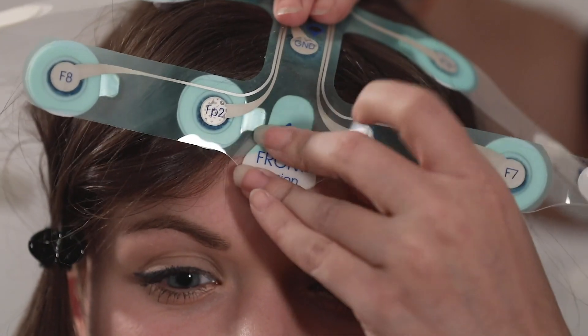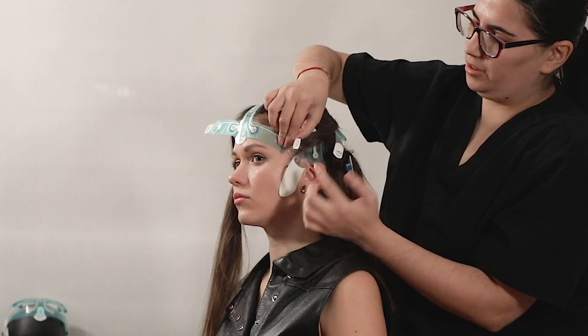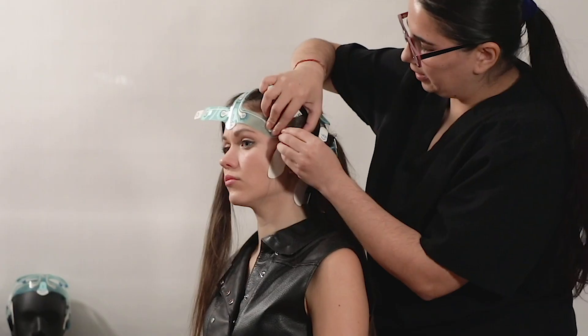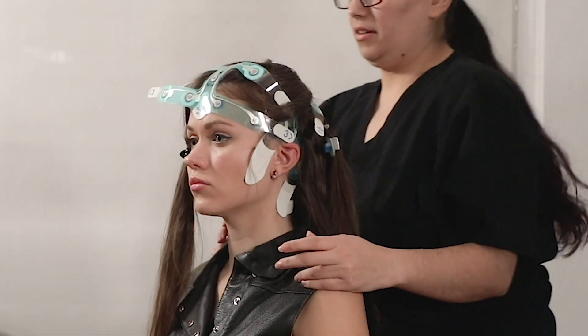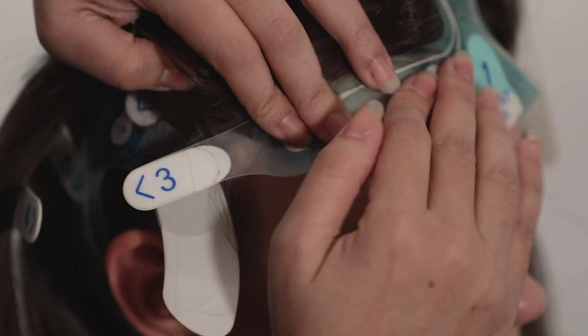Secure NeuroCap along the forehead with strip number three: with number one of the NeuroCap secured on the forehead, apply strip number three on both sides flush along the forehead and over the earpiece area, marked number three with two arrows. Repeat for both the left and the right side of the forehead.